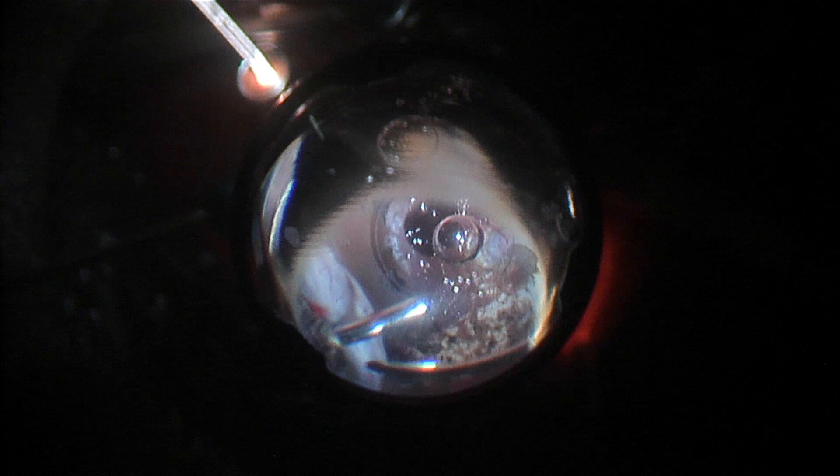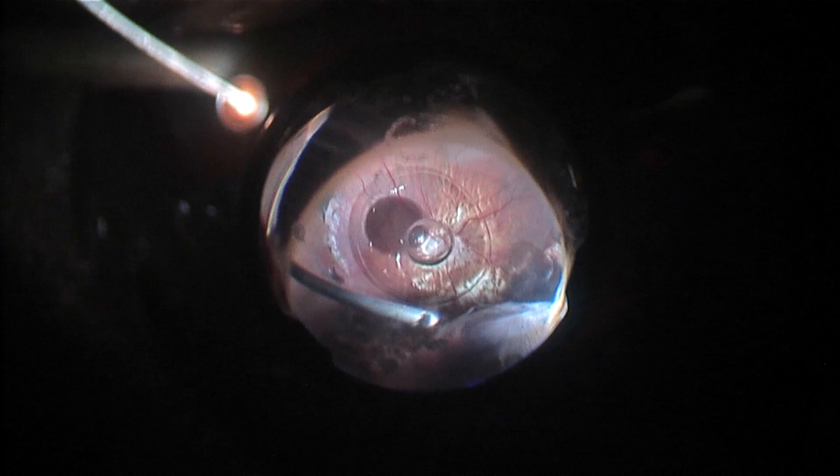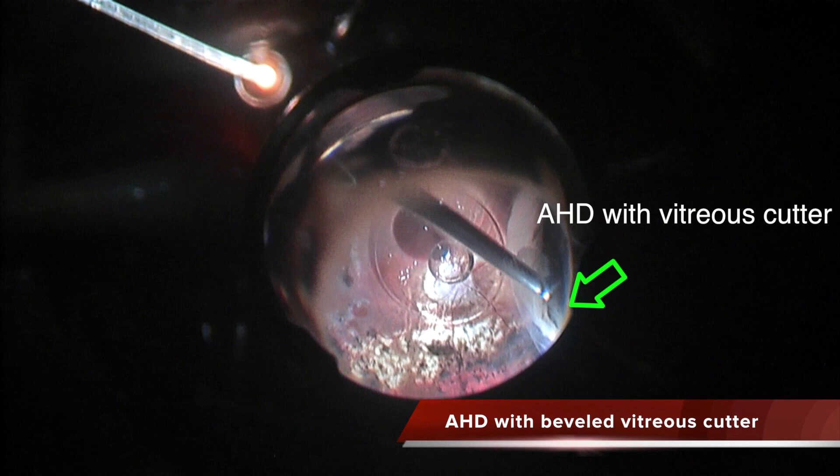After opening the space and lifting the anterior hyaloid, I am shaving all the remnants with the cutter. I will complete this anterior hyaloid section. This is the scarred area I mentioned related to the previous sclerotomy. Once I cut this tissue, the retina is much more relaxed and there is no anterior contraction. In other areas where the scarring of the anterior hyaloid is not so severe, you can do this with the bevel cutter.